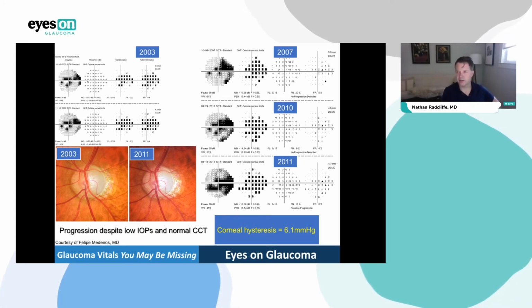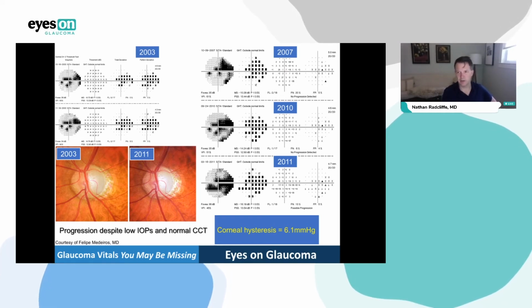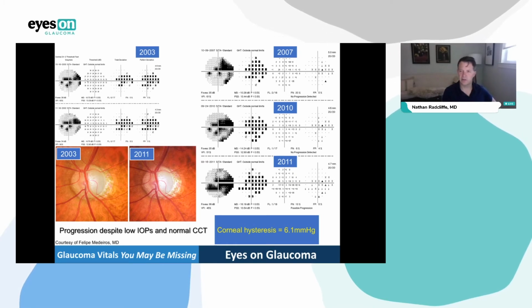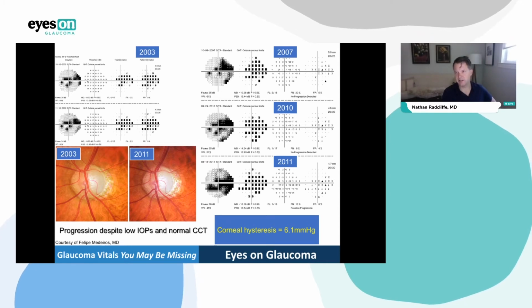I get a corneal thickness on every biometry before cataract surgery. I still always kind of take a look at that number. And I think at some point it'd be almost tough for my brain to stop looking at corneal thickness. But if I have a patient where the hysteresis and the thickness are kind of disagreeing with each other, I go with the hysteresis. That's the key, is to just have faith.